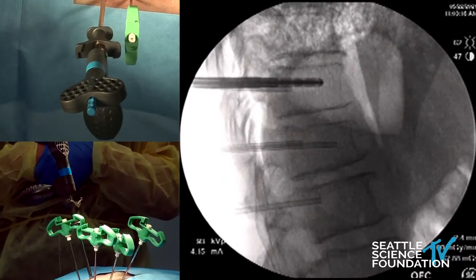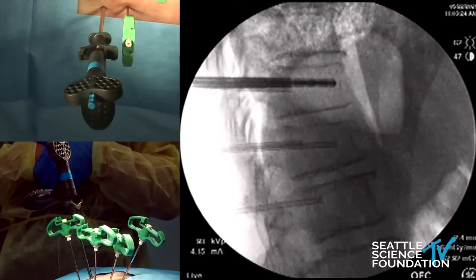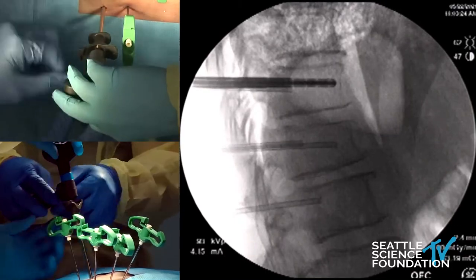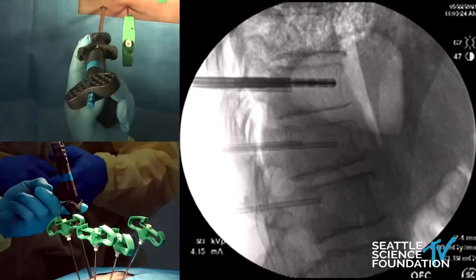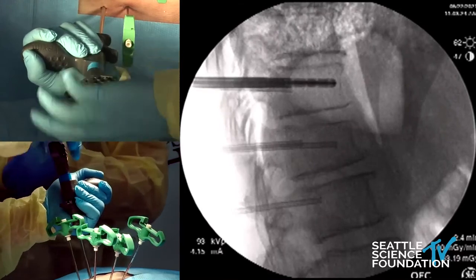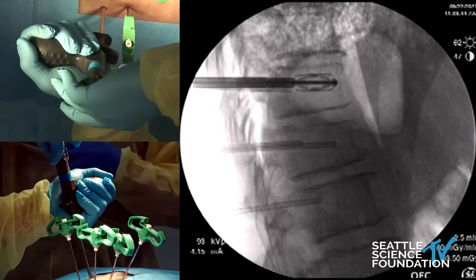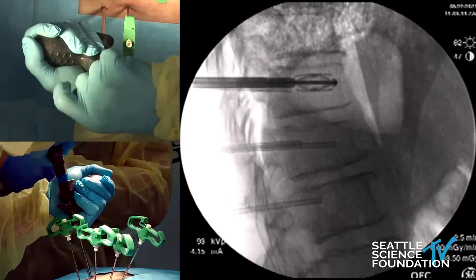You may want to tap that forward just a touch. Go ahead and crank that up. Hold it stable and give us some rotations. You can see that it is expanding. We're trying to restore a fairly normal vertebral body here — this would be used in a more kyphotic segment.